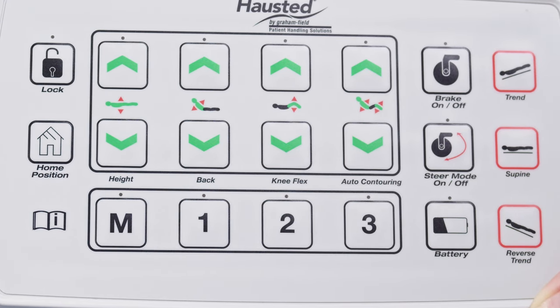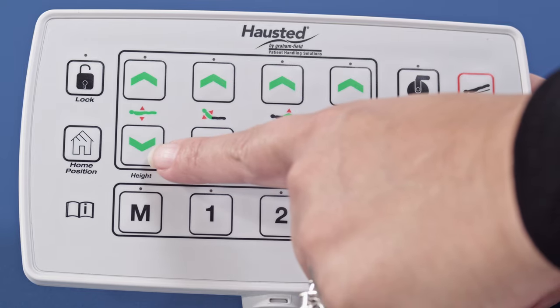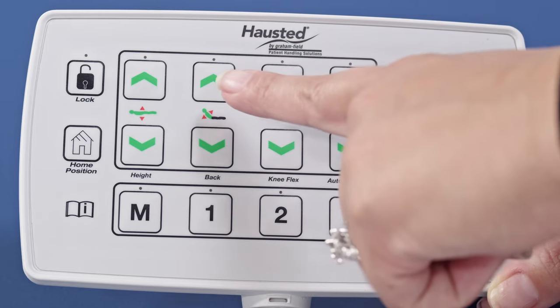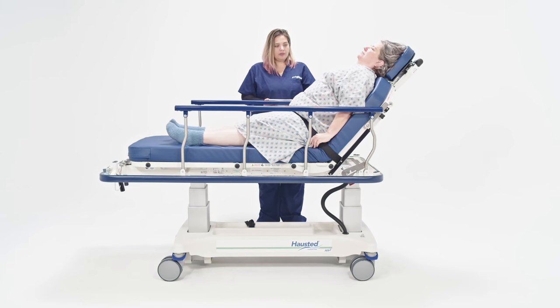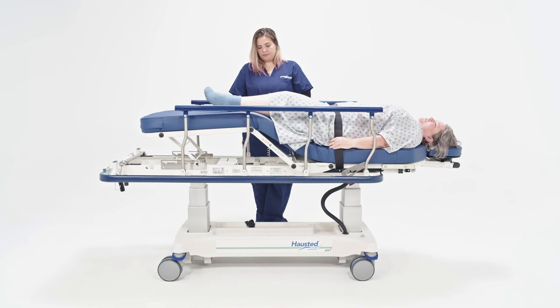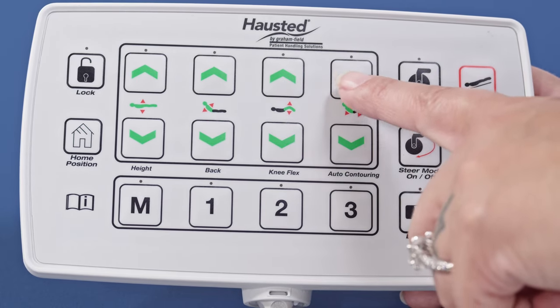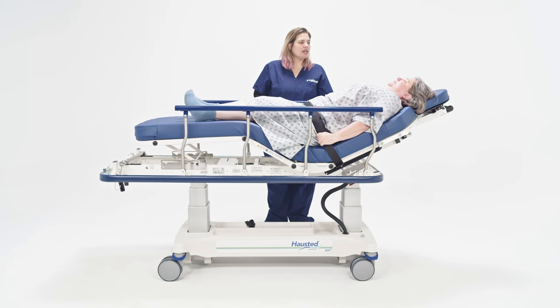The 5E82 pendant has special buttons for height, back, knee flex, and auto-contouring that can be held down until the desired position is achieved.